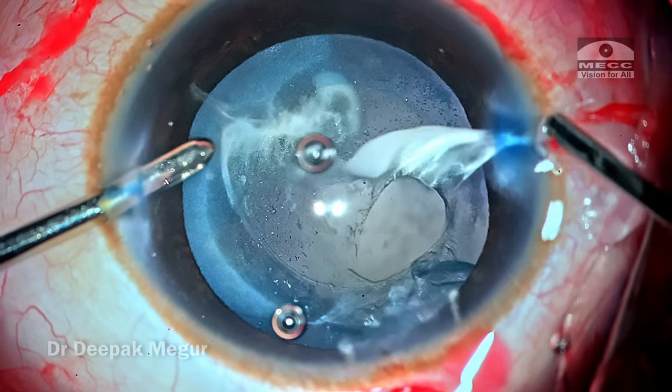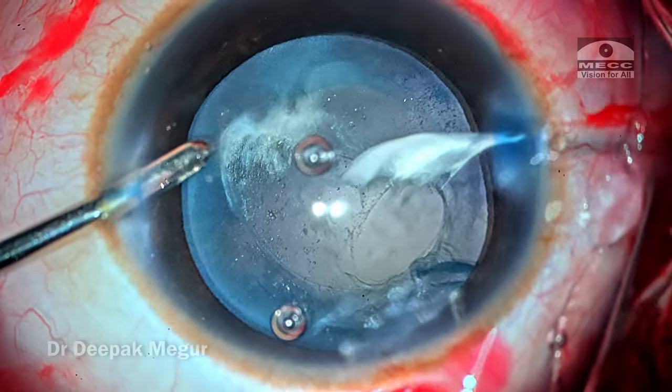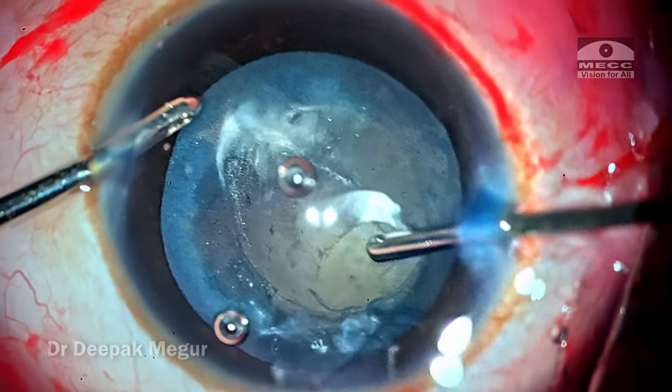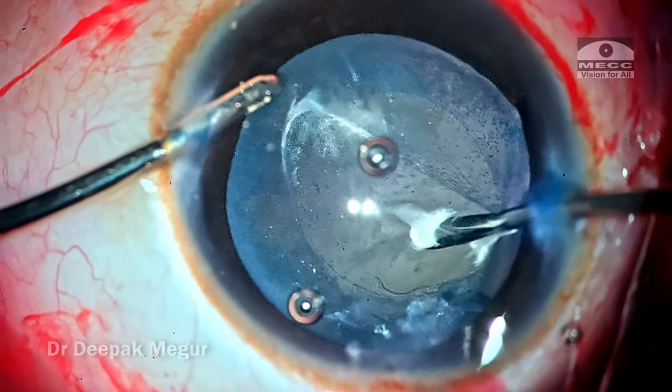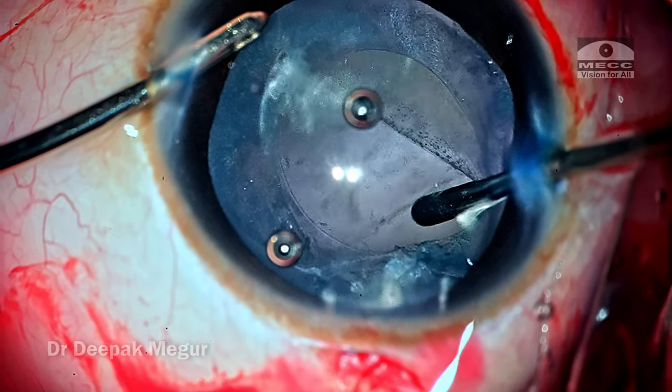You can see the vitreous peeking its way towards the wound. Time to perform the anterior vitrectomy. The vitrector takes care of the vitreous near the wound, and then it is positioned below the level of the posterior capsular tear and below the anterior hyaloid tear to perform a limited anterior vitrectomy.